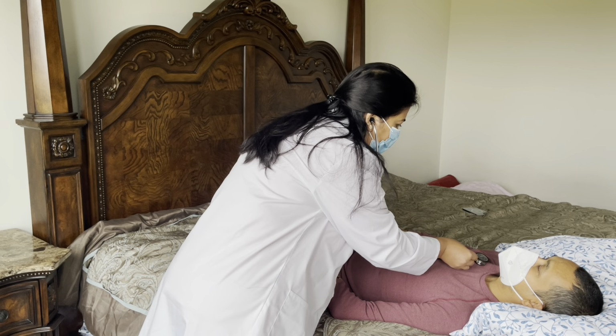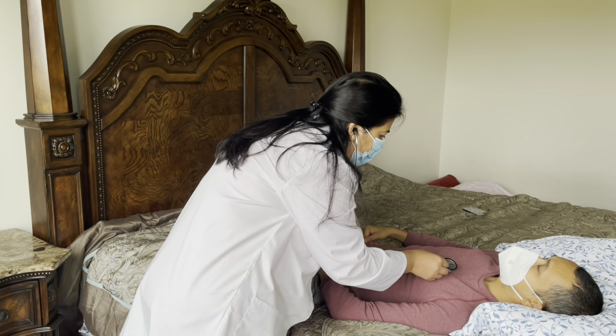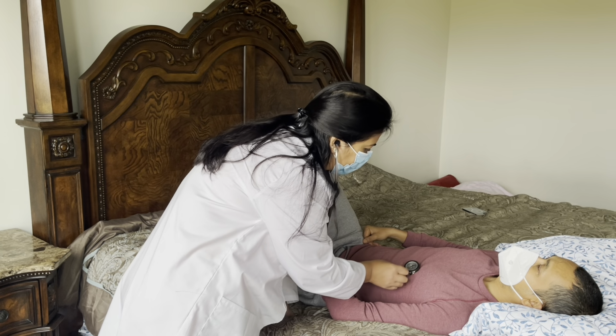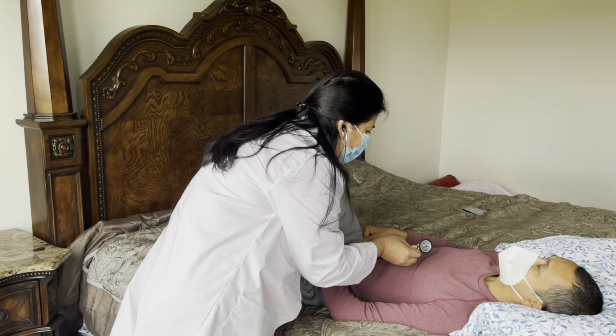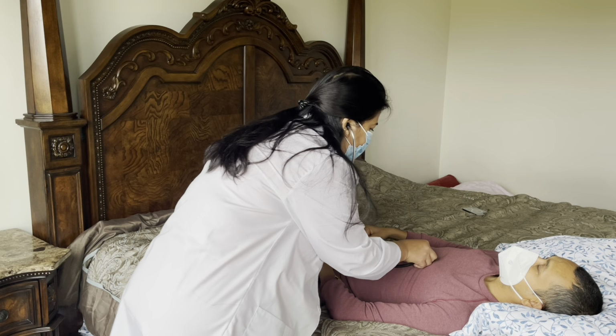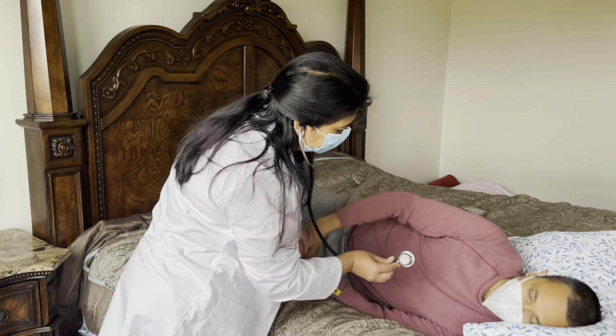I'm going to repeat with the bell of my stethoscope. Aortic, pulmonic, Erb's point, tricuspid, and mitral, where I did not hear S3 and S4, which is normal. And then epigastric here, I did not hear any swishing or blowing sound. And then could you lay down on the left lateral position?